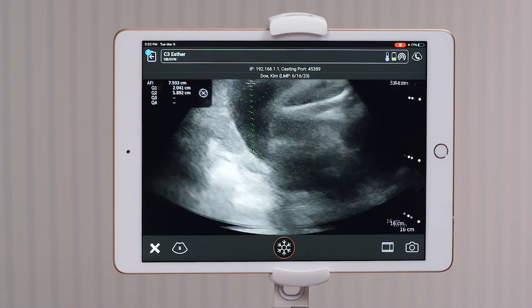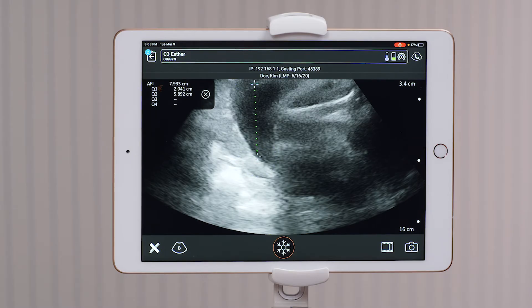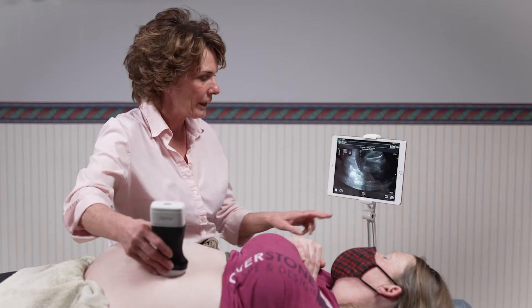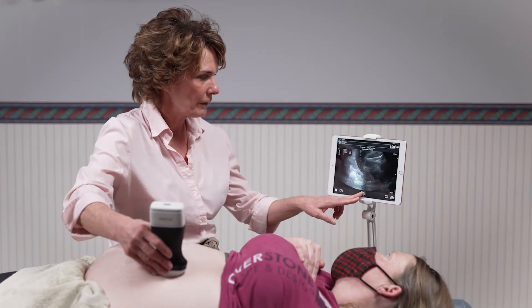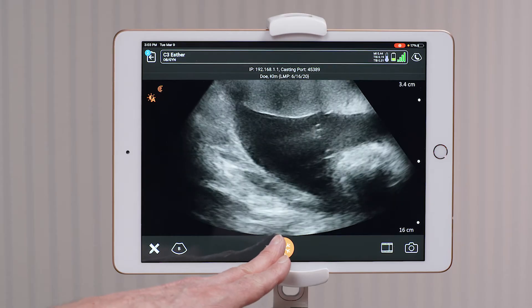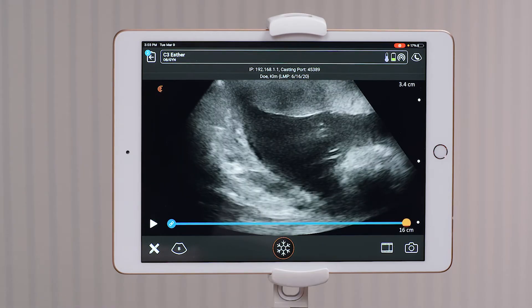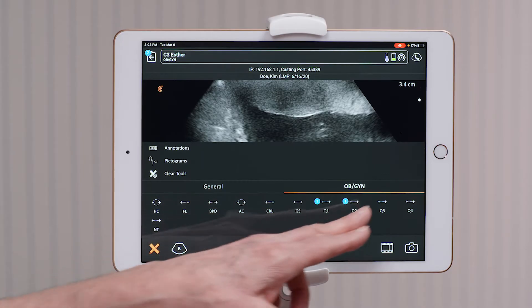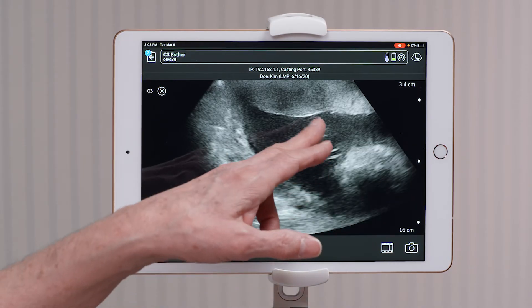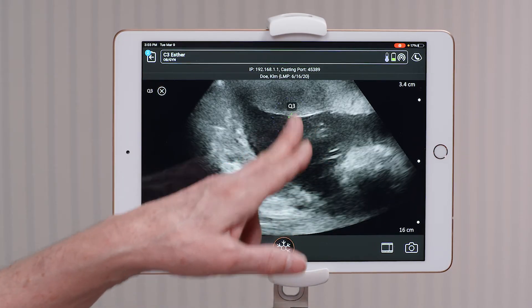Once I've taken a picture of that, I would move to the left upper quadrant for my next measurement. I would freeze my image, go to my measurement tools again, and do my third quadrant of fluid.